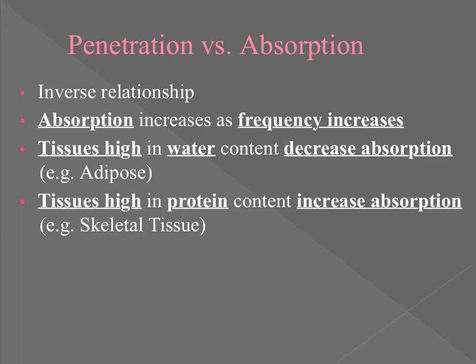Okay, you guys, I think this is a very intuitive concept, penetration versus absorption. So if we were to define penetration, it is the ultrasound energy that's able to pass from one layer to another, right? And then absorption is energy that's stored by a layer and is transformed into kinetic energy, right? So we have those two different concepts. What we know about the two is that there's this inverse relationship. So just think about it this way.